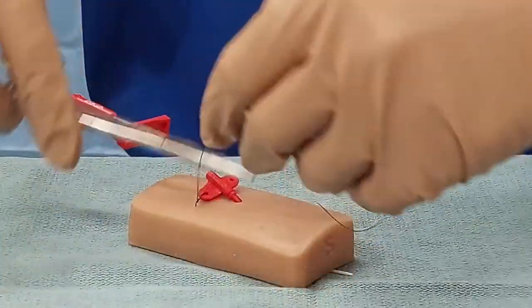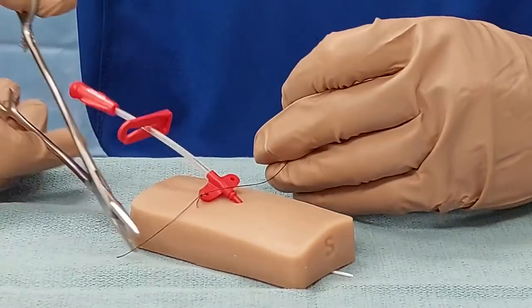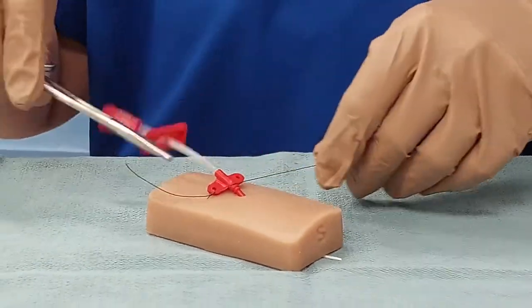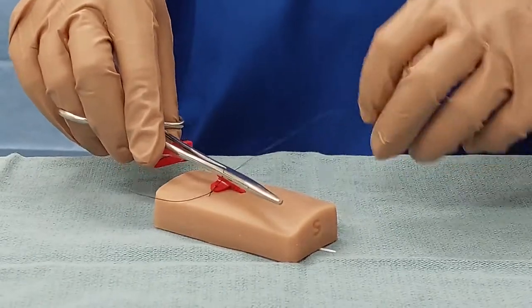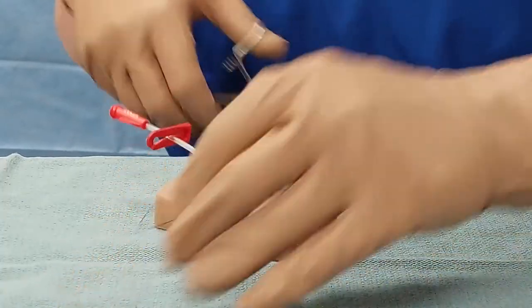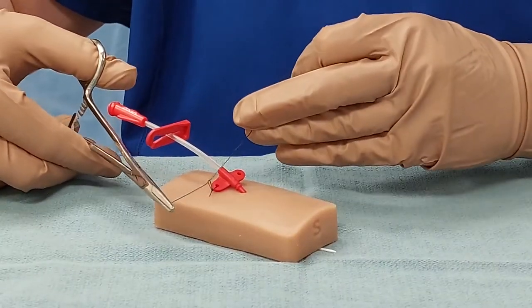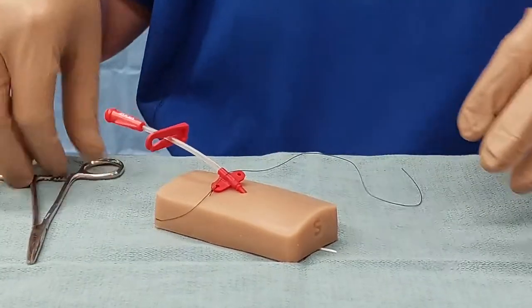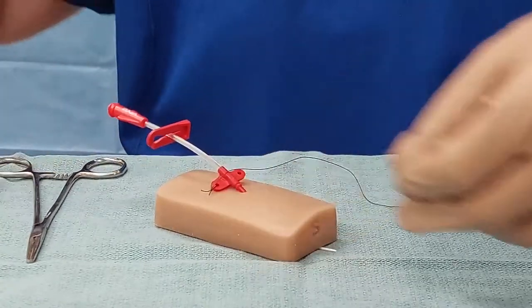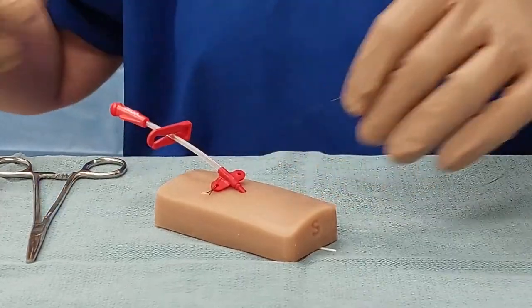Now I've got my twists on top again. Pull that through and pull it down nice and tight. Check to make sure I haven't got any blanched skin and I'm not pinching. Needle drivers go over the middle, do one loop and pull it down tight. And there's my last one — a nice loop with the twists on top, pull it down and tighten. Now I'm going to cut my suture threads and leave approximately half a centimeter. You just need to make sure it's not going to unravel.